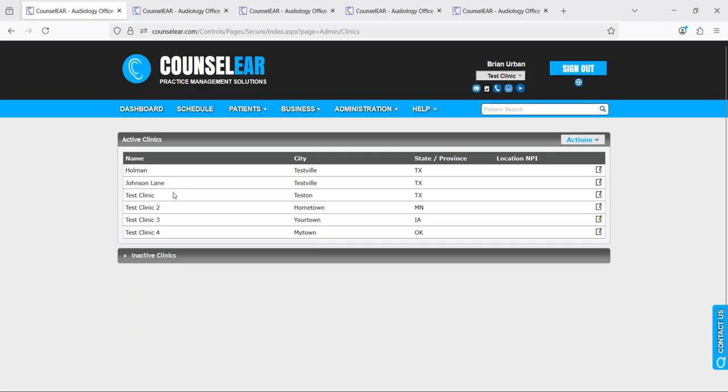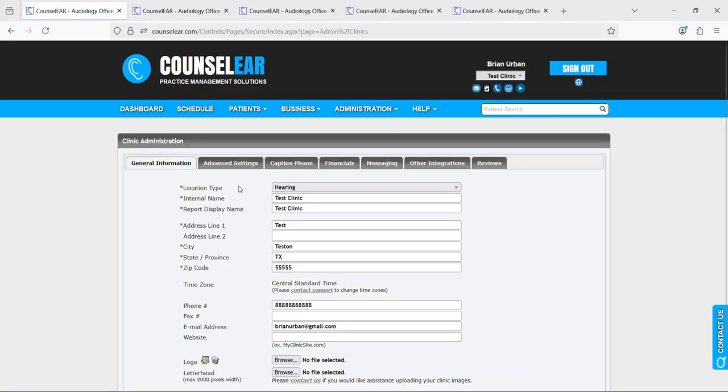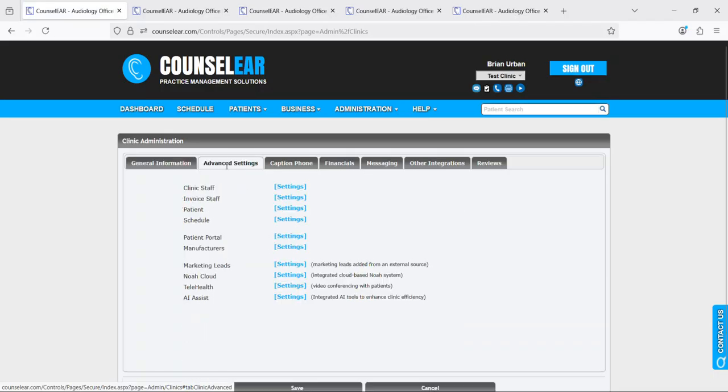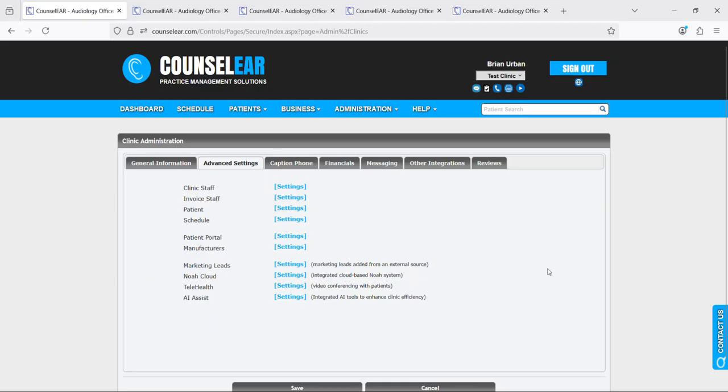Now in your clinic list, go ahead and select a clinic and click the edit option, then choose advanced settings, and then right here we're going to select AI Assist settings. If this is not already checked, go ahead and check that box, click close and very importantly click save.